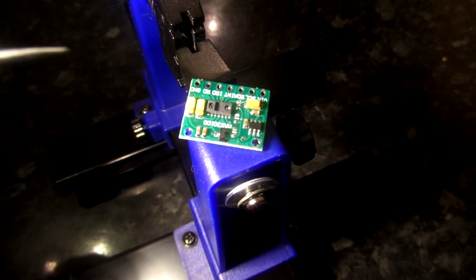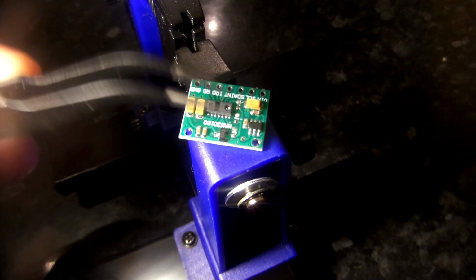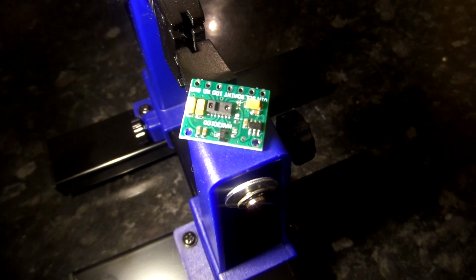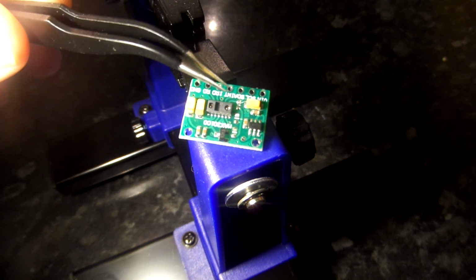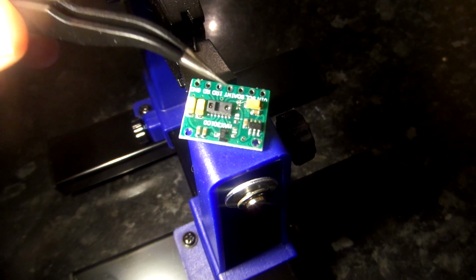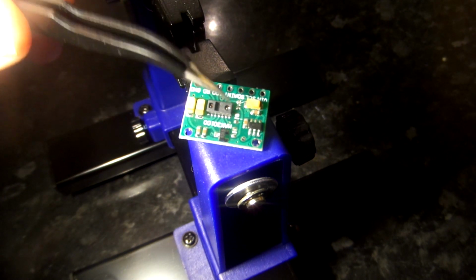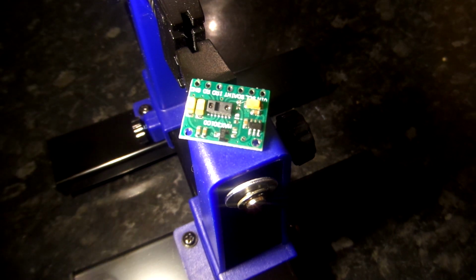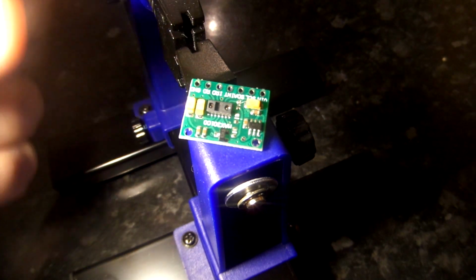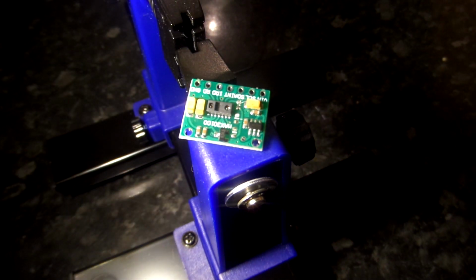So there we are, all removed. It was really easy. It was around 30 seconds to a minute job. Extremely easy when you've not got all the camera and equipment around you. All I did is heat up one side of the resistor, the solder melted, I had my tweezers on, then heated the top of the resistor and just eased, and it just pulled off. It took between 10 and 15 seconds each one, if that. So it was all done really quickly. So don't be afraid, if you've got a solder iron, that was a really easy job to remove them.